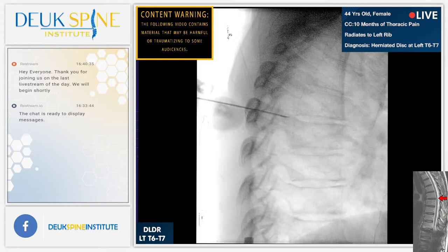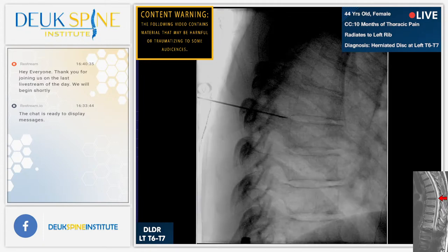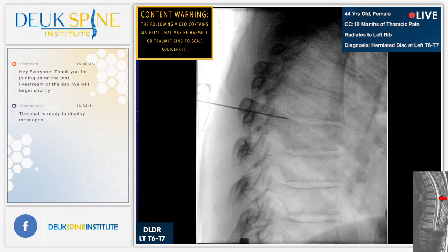Try to give me a little bit better exposure. It's just overexposed. Looking good. We're right at the back of the disc. I can actually feel the herniation. I'm advancing the needle a little bit at a time.